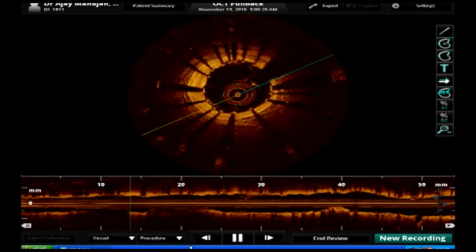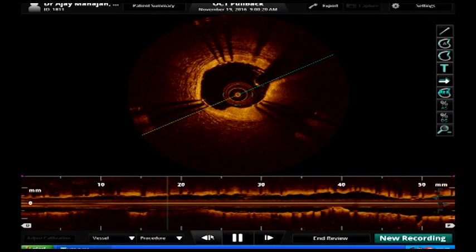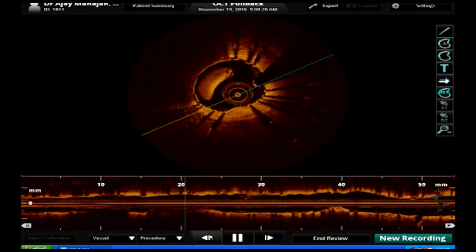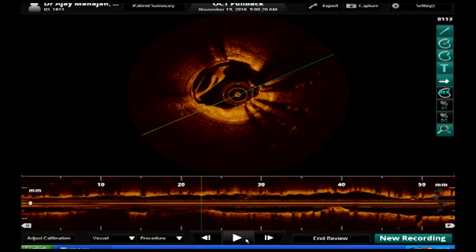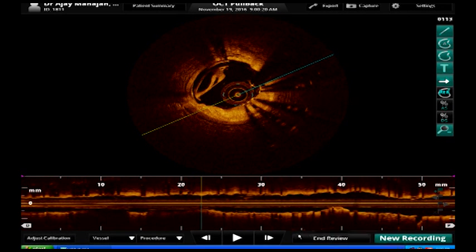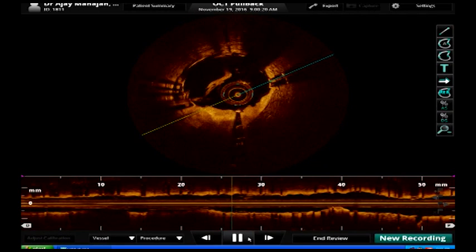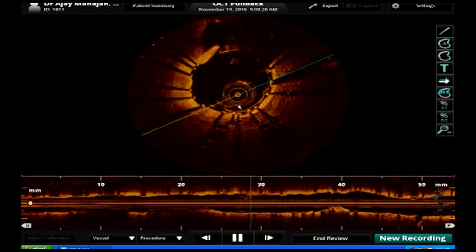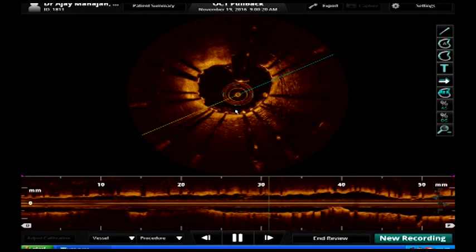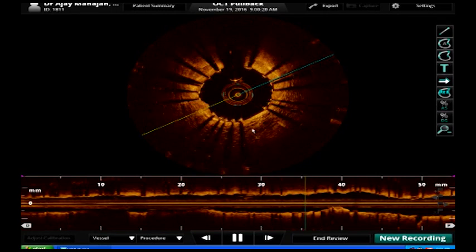If I may comment, I would go for the larger stent because the proximal LAD is usually 3 at least. I'm not afraid about oversize at the end of the stent. It's always the risk of dissection, but it's a drug-eluting stent, so I'm not afraid about 10-20% of oversize. And I would definitely go with IVUS first, because not only the vessel size, I prefer to place the stent in a normal part of the vessel. I want to know where disease ends and where is the landing zone for the stent.